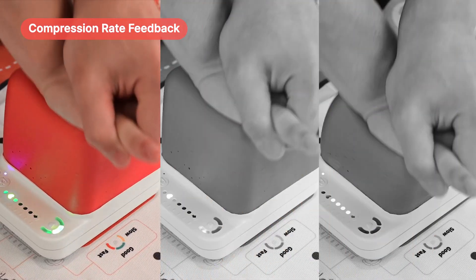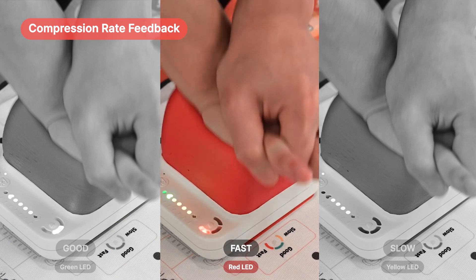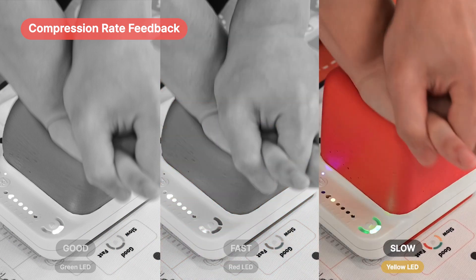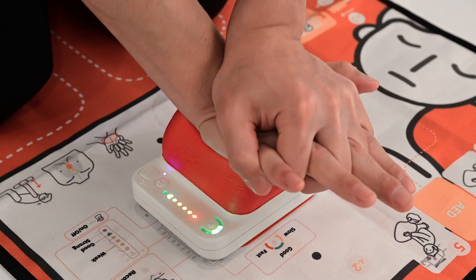Students can receive feedback on their CPR performance through LEDs. If the compression speed is appropriate, a green LED will be displayed. If it's fast, a red LED, and if it's slow, a yellow LED will light up.